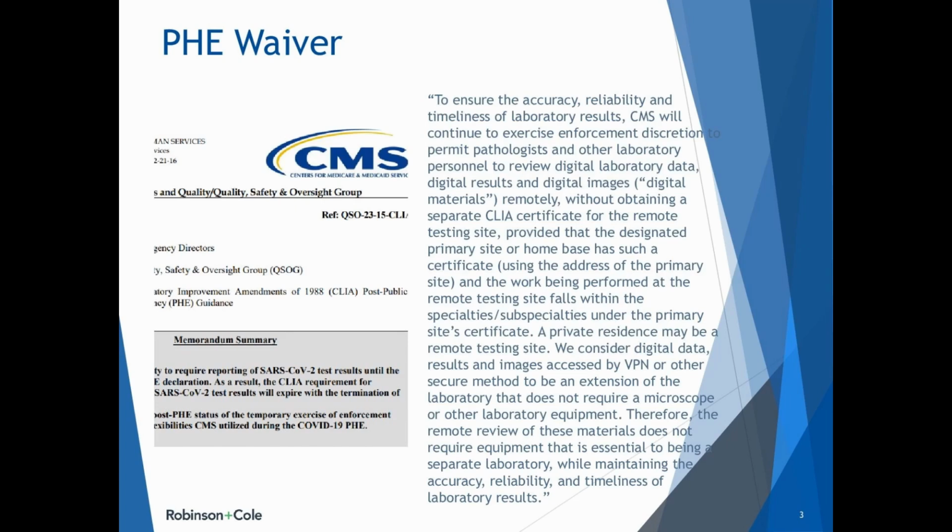New York's just one state, but for all those who are in New York, you need to keep in mind what CLEP has to say about digital pathology, and then also think about any other states that you're in and the regulations.